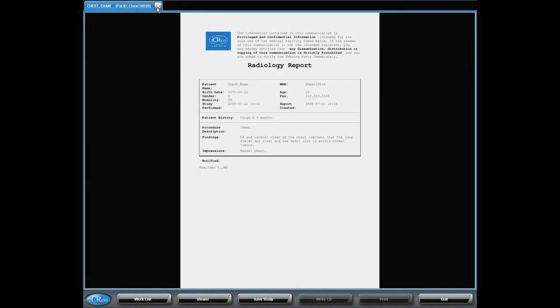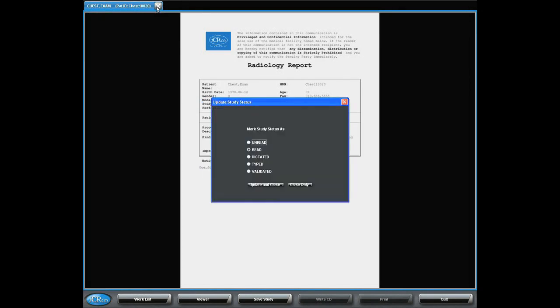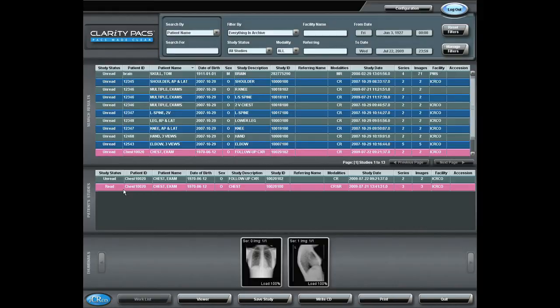So, as I close this study, I'm once again prompted, and I will change it to red, and then I will close. Now that case indicates that it has been red.